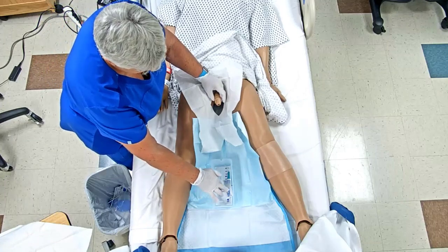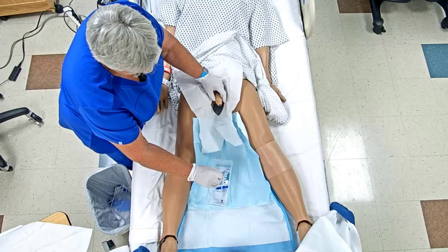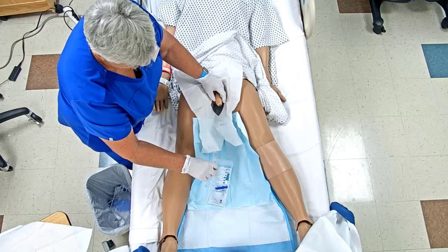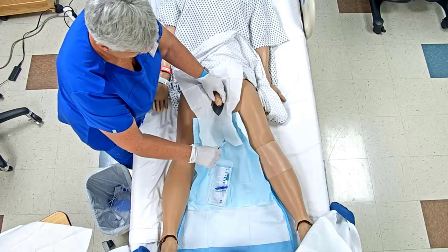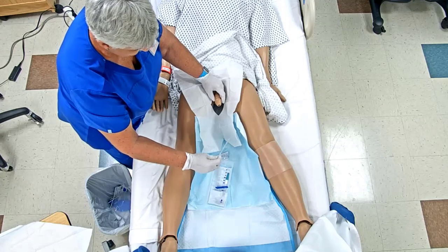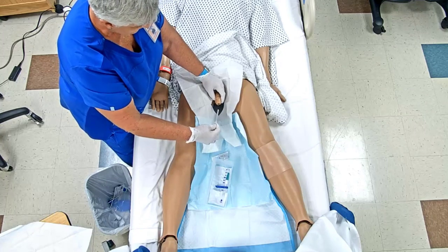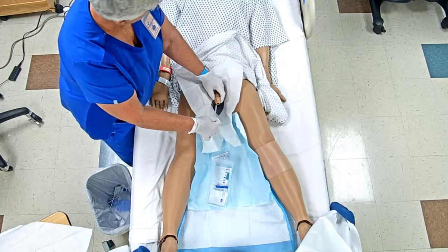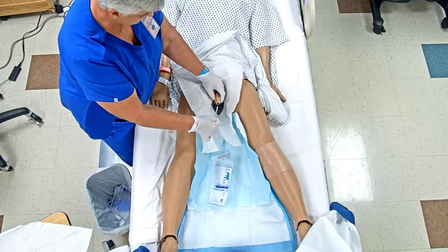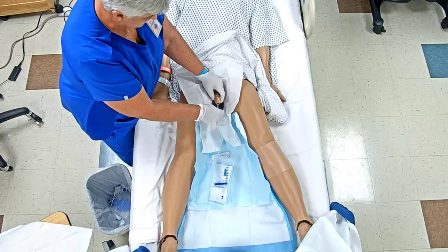Now I'm going to reach in, and I'm going to get my lubricated catheter. Okay. Now when I start inserting this, I don't want my sterile hand coming in contact with the patient. So I'm going to hold it so that I've got control. Okay, so on the count of 3, I want you to take a deep breath, and I'm going to go ahead and insert it. It may just be a little uncomfortable. Okay, 1, 2, 3, take a deep breath. We're going to insert it.